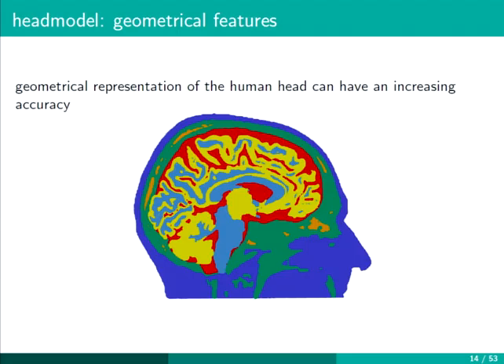We try to calibrate the skull conductivity of individuals, starting from combined EEG and MEG measurements of the somatosensory evoked potentials that you saw. We use the MEG for the source location, the EEG for the orientation, and then the MEG for the magnitude again to reconstruct the dipole. In the end we compute the residual variance to the data and pick the conductivity that yields the best residual variance.